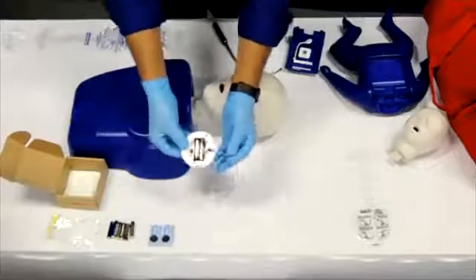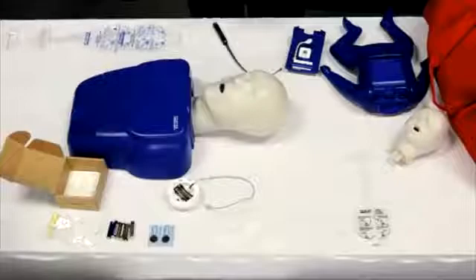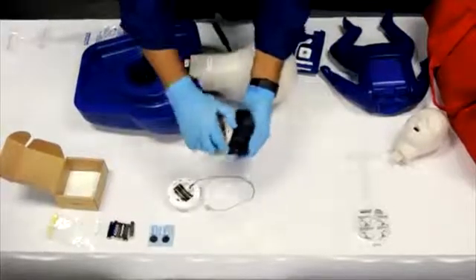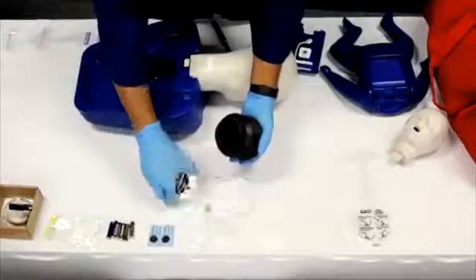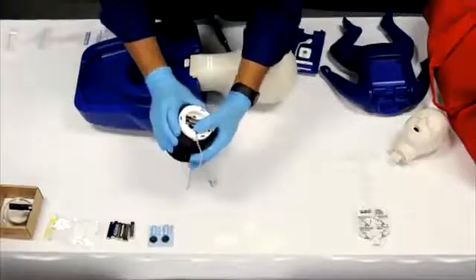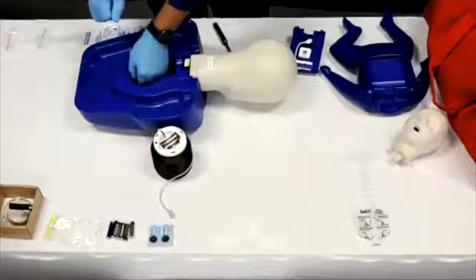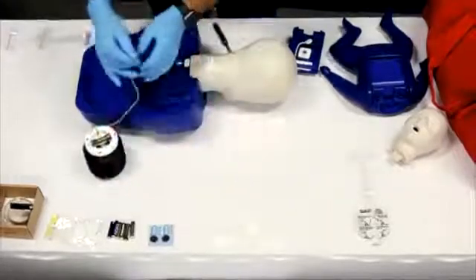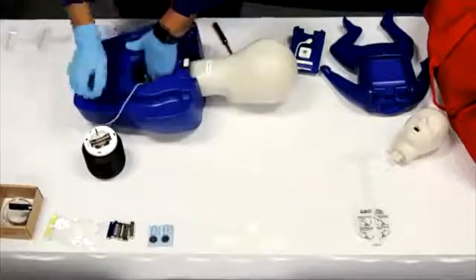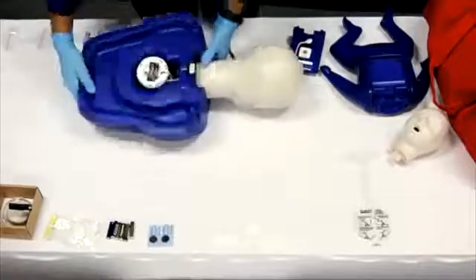At this point, we are going to show you how to get the electronics in your mannequin. The CPR Prompt Plus electronics screw to the top of the bellows piston and fit into the back of the torso on top of the installed lung bag. So as you can see, we are taking a piece out and we will replace it with the electronics. Basic Buddy Plus looks a little bit different and we will show you that later. So we'll get that and we'll insert it into the cavity, and be sure to make sure you plug the cord in, otherwise you won't get any feedback. This step is important. And once you're done with that, you can press the black button on the electronics component to activate.